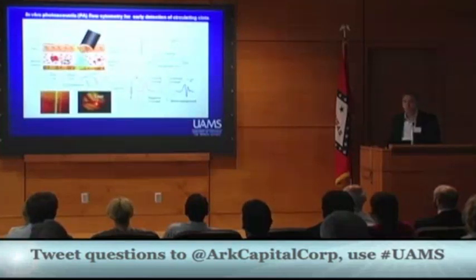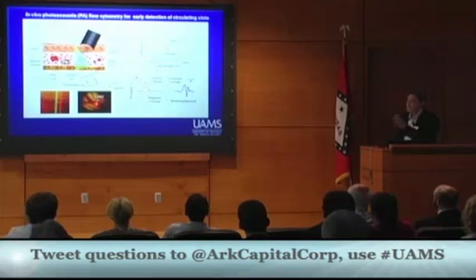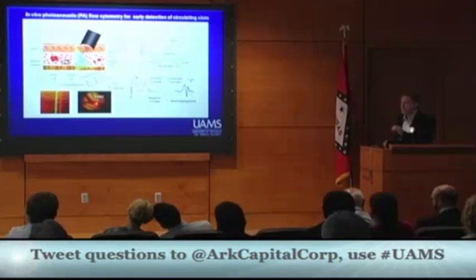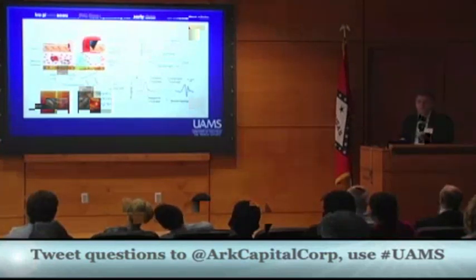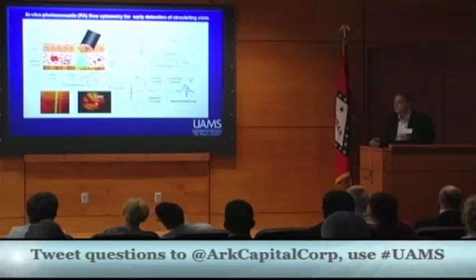How does it work? Just a few scientific details. It's a combination of laser and ultrasound. It's the photoacoustic effect, a transformation of light into sound. When there is lightning in front of you, you hear sound. Likewise, a laser is absorbed and heats some volume, and a very fast thermal expansion produces sound. That's why, instead of detection by imaging, we can hear cells.